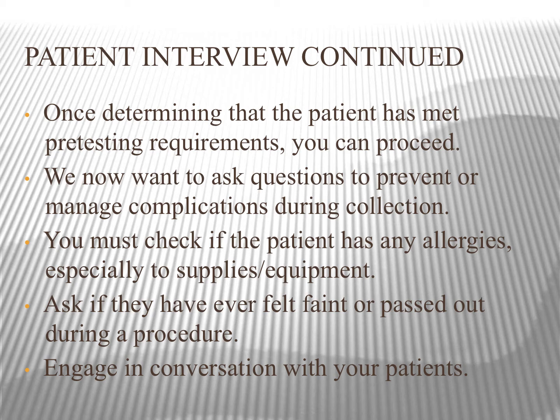And then again, with the fainting or passing out, we want to know that ahead of time so we can be prepared for that, so we're not caught off guard if the patient does faint. And really engage in conversation with your patients, like I said before. That's going to make them feel a little bit more at ease. And hopefully we can make that blood draw go well for the patient and for us.